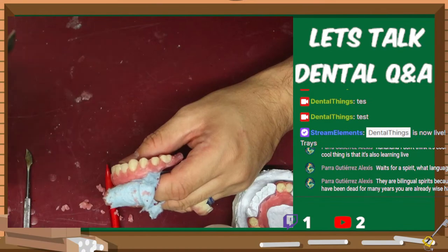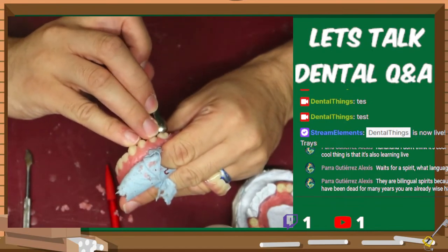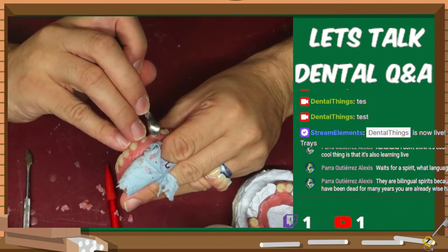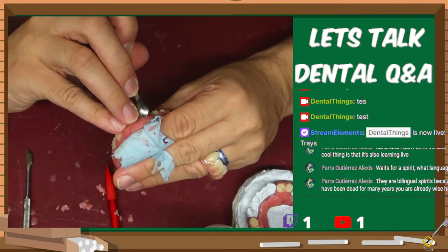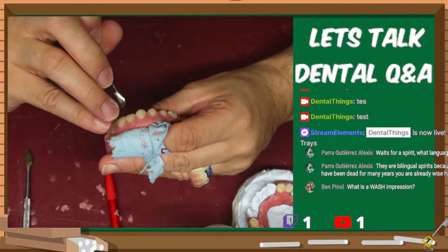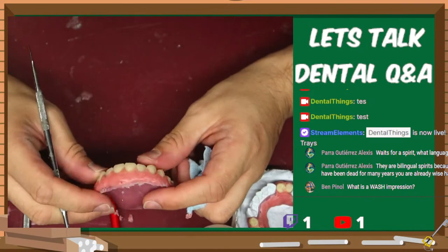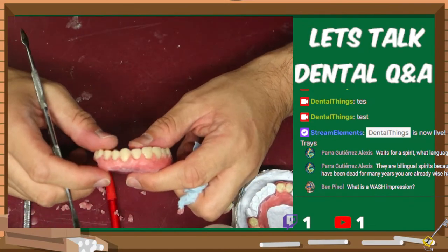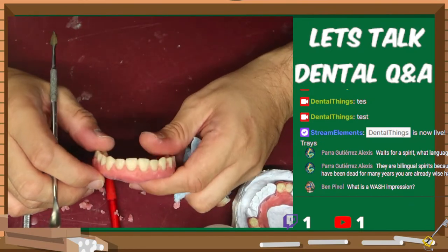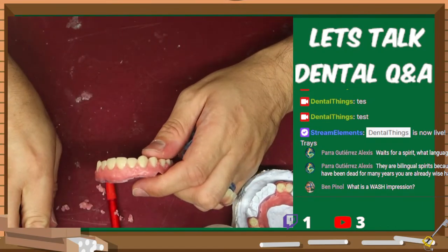Let's go and push these gum tissues up a little bit. Heat that up for a quick second. And that works fast. Let me go ahead and flash this a little bit.